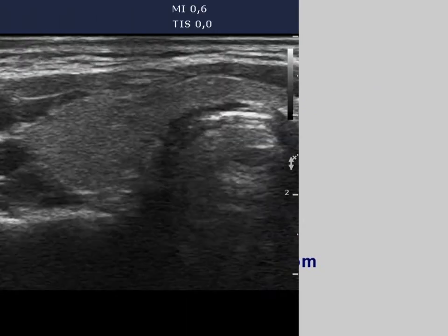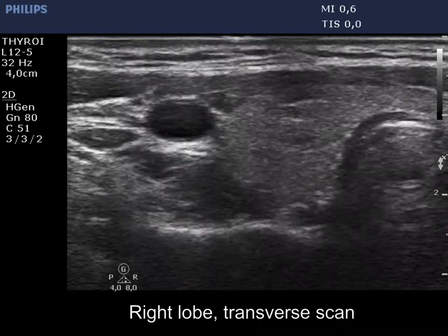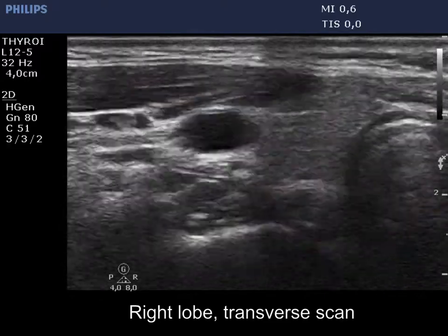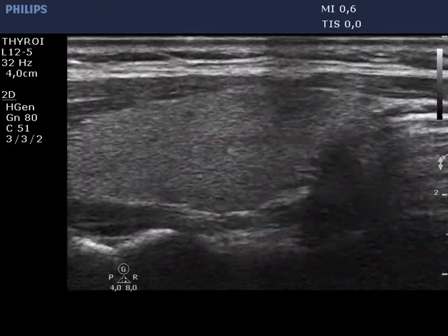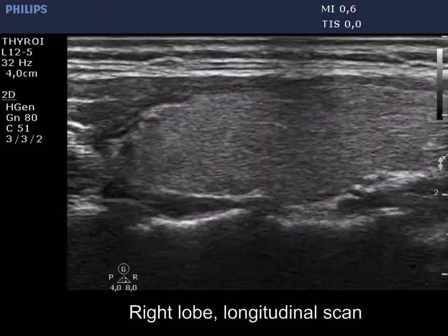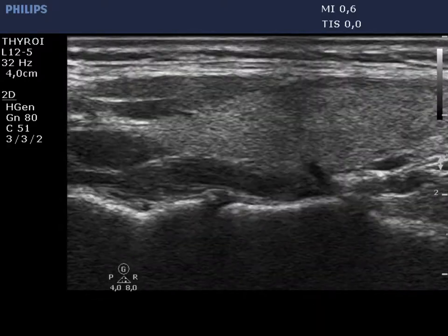The right lobe is intact without any discrete lesions. Note the dark band starting from the level of the skin — this is an artifact.